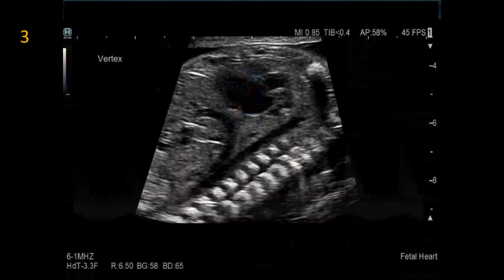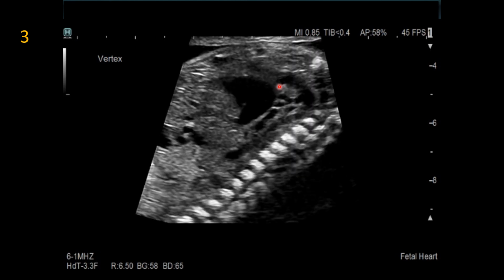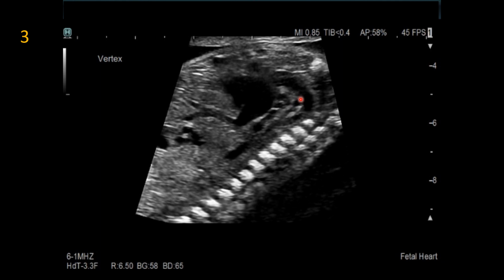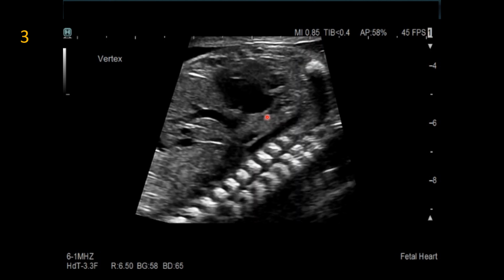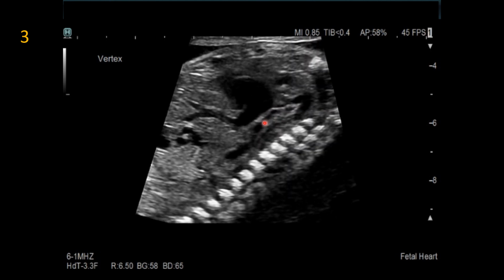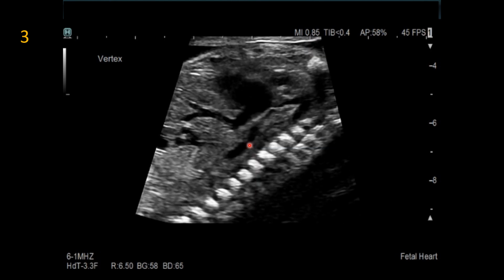And so into a sagittal view here, we have the spine back here, this is anterior, this is the common atrium, and you're seeing the aorta here. This is what looks like the ductus arteriosus, reverse oriented ductus coming off. But importantly, you see this structure here, this linear venous structure here behind the common atrium, running parallel with the aorta, about the same size as the aorta, so to scale with the aorta.